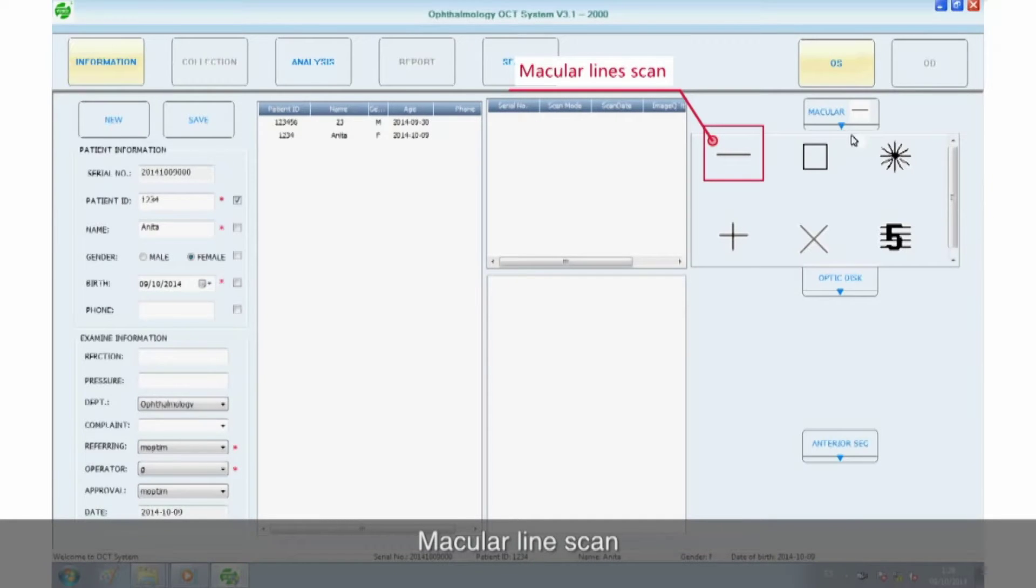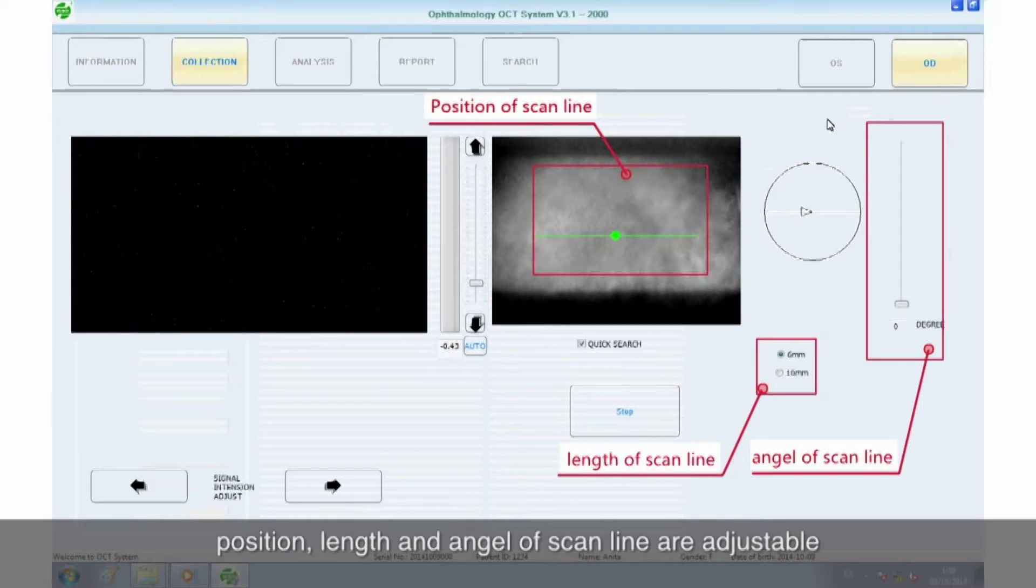Macular line scan. In this mode, position, length, and angle of scan line are adjustable.